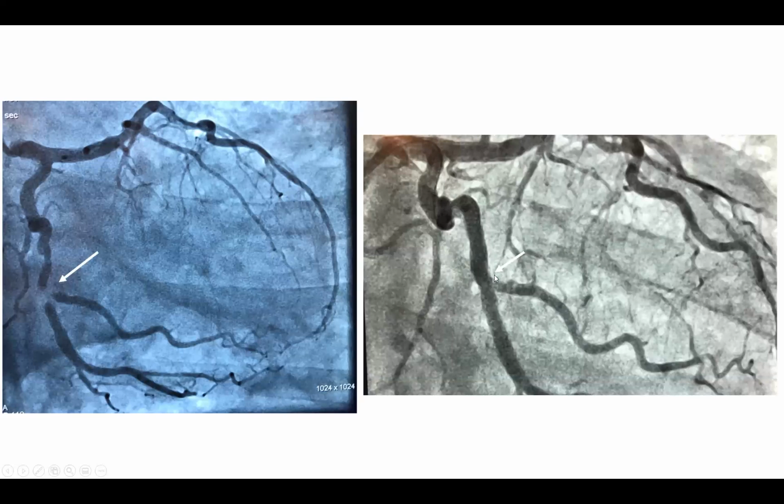You have to take into account, if you choose to be aggressive here, it will be very hard to rewire a stent in this case. Like I said, it's hard to rewire a stent. It's particularly hard in a distal vessel, particularly hard if you have to cross multiple tortuosities. This left circumflex is very tortuous and calcified. So if you want to rewire across that, you have less wire control.